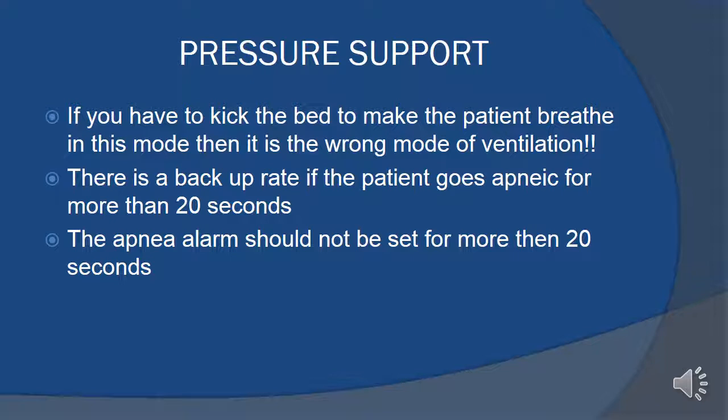Now, there is an apnea setting in there. It's based on seconds, and your apnea alarm should not be set for probably more than 20 seconds. In other words, if the patient makes no attempt to breathe whatsoever within that 20 seconds, the machine will go into a backup rate, a backup mode. That's a safety feature to protect your patient, all right?